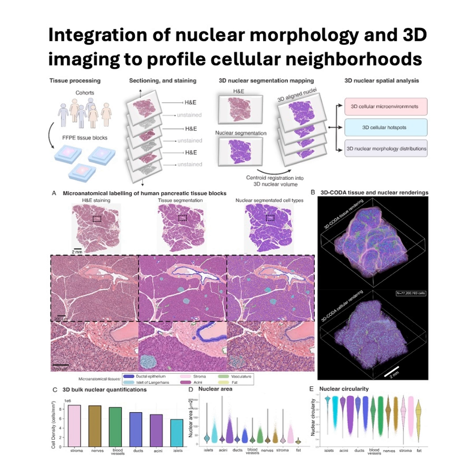It all started with human pancreatic tissue. From a donor? Yes, obtained from a healthy organ donor through the NPOD network, that's the network for pancreatic organ donors with diabetes. Using real human tissue is obviously key for relevance. Makes sense. So they have this block of tissue. What next? Slicing. Exactly. Imagine taking that block and slicing it incredibly thin. We're talking 4 micrometers thick sections.